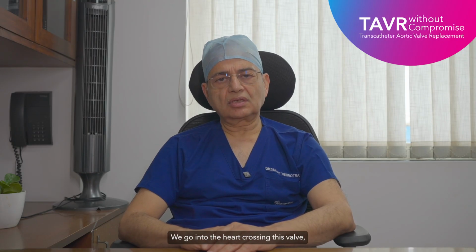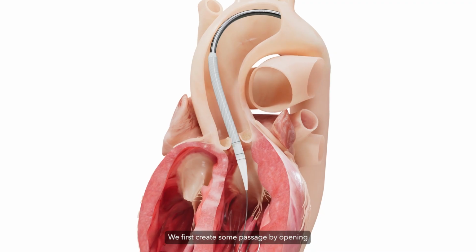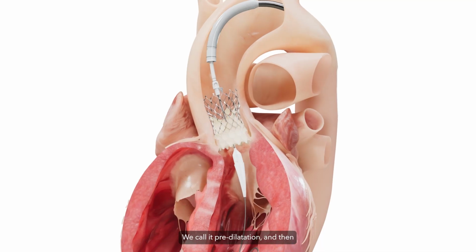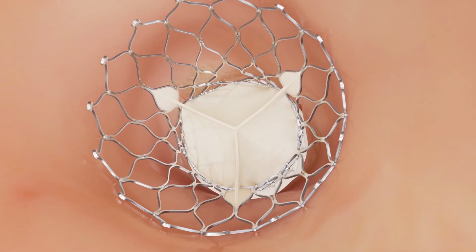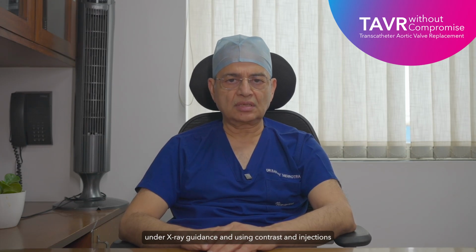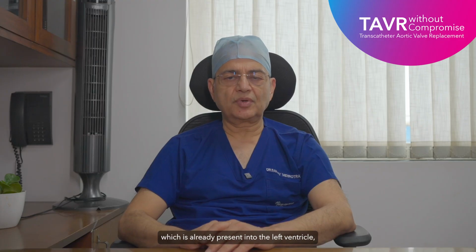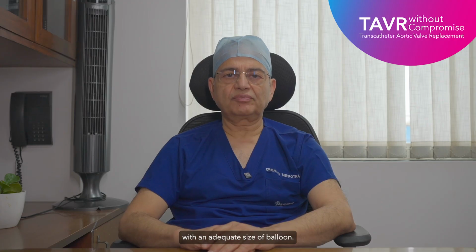We go into the heart, crossing this valve, which of course is a slightly difficult phenomenon because the valve is very small. We first create some passage by opening the aortic valve with a balloon. We call it pre-dilatation. And then we take the device, which is advanced over a wire system. All of these procedures are done under X-ray guidance and using contrast injections in various parts of the heart. The device is inserted and railroaded through the wire, which is already present, into the left ventricle after the valve has been pre-dilated with an adequate size of balloon.